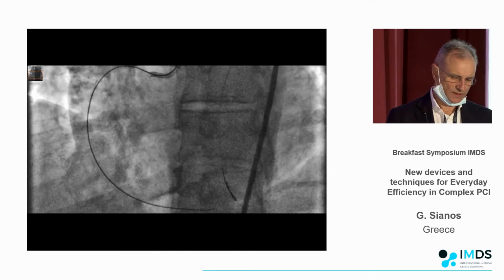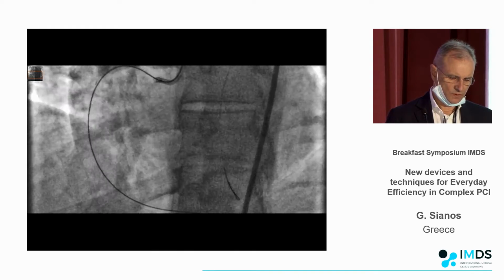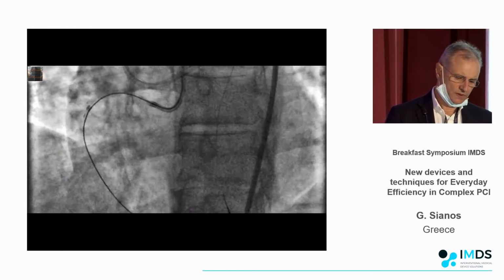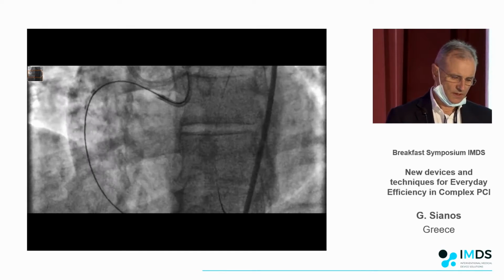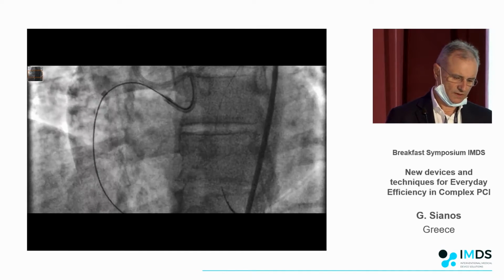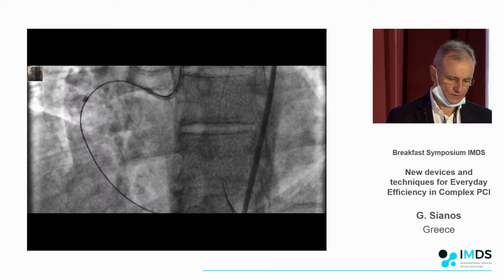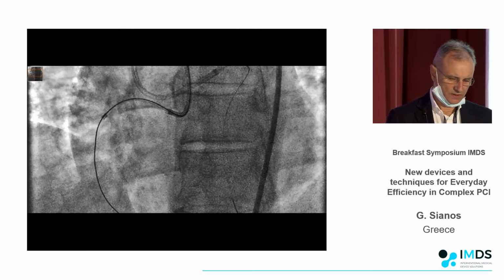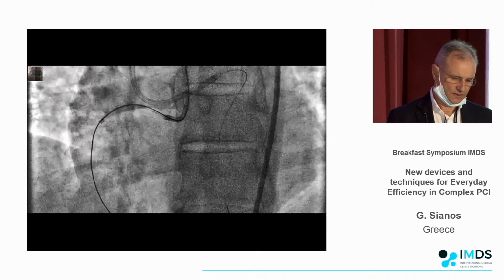I'm pushing it, and you see that the marker deflects from the vessel wall and stops there. So we brought a guiding catheter extension, the Guideliner here, and we pushed it, and the balloon gradually moves forward, and it's very hard to see here. Essentially the balloon is crossing.